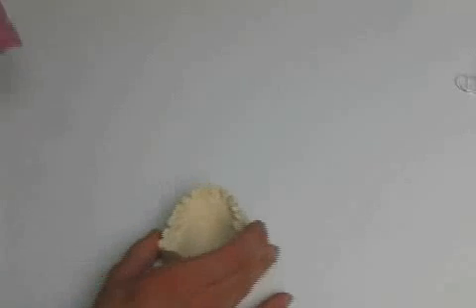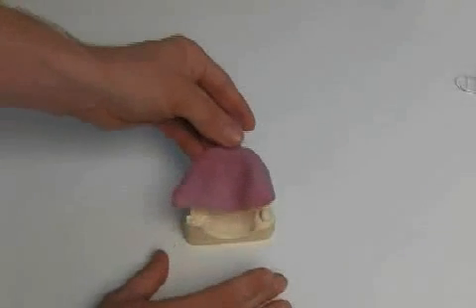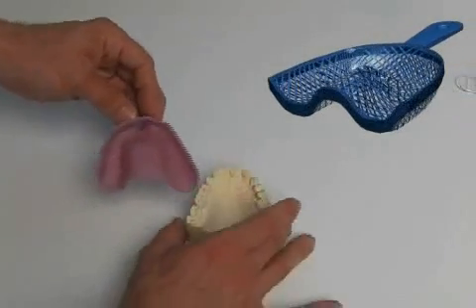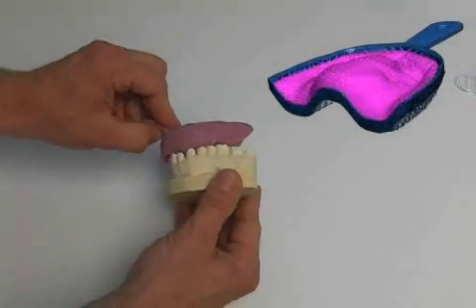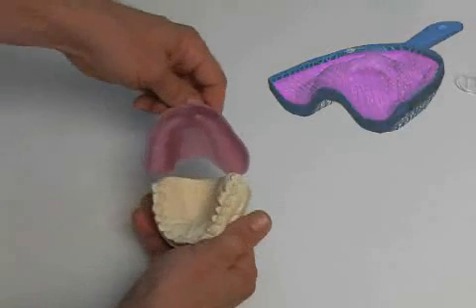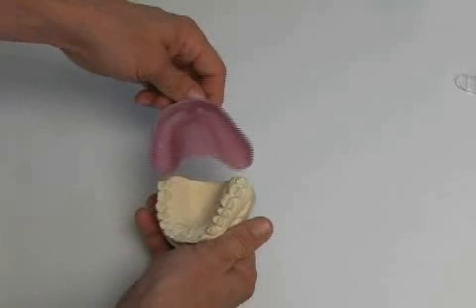With individualized trays, the dental technician produces an individual impression tray customized to your jaw. In order to do this, a pre-impression is initially taken with a prefabricated tray. This provides the technician with a rough overview of your jaw, from which he can produce the individual tray.